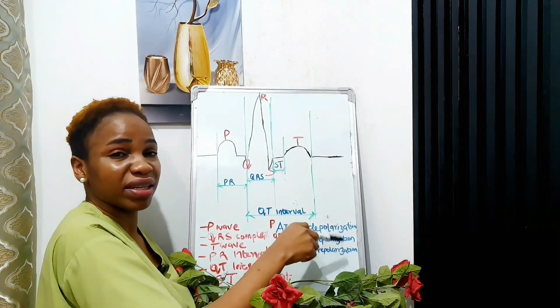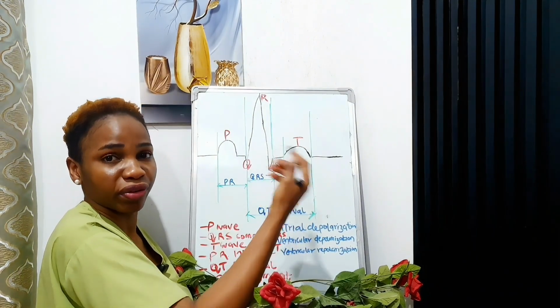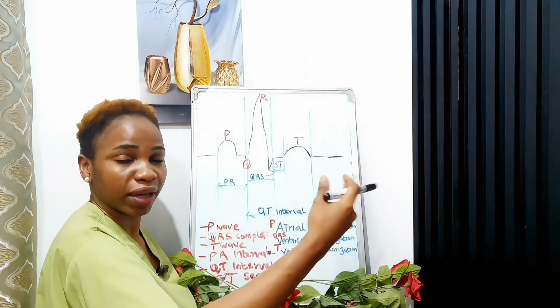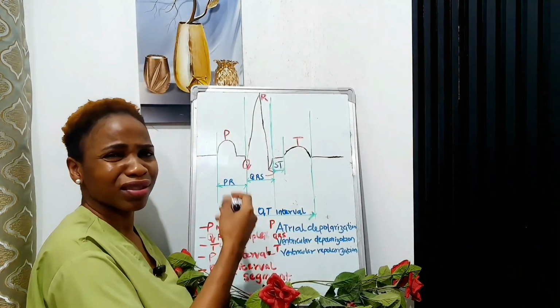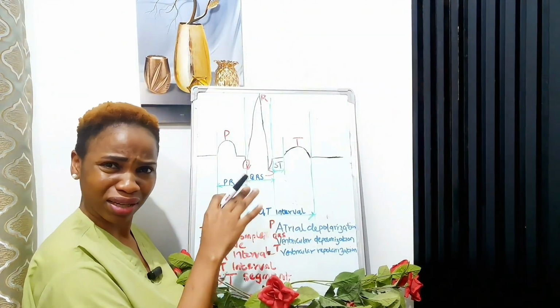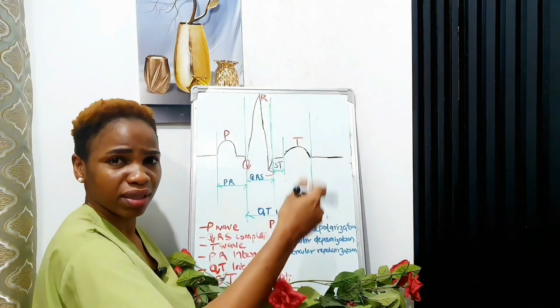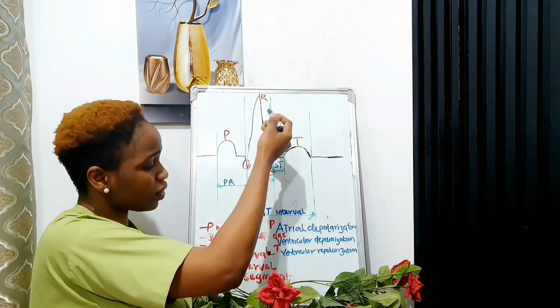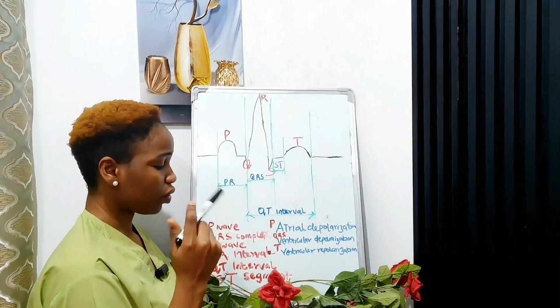This is just like a resting phase, the heart trying to prepare or refill for another heart cycle to start again, another heartbeat to start again. Okay, this takes about a few seconds. It's not like it's going to take a few minutes for you to refill. Just within a few seconds, just the circulation. So this is what happens during these PQRST waves. I don't know if that makes sense.